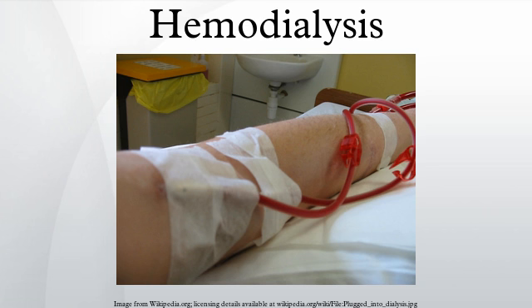Disadvantages: restricts independence, as people undergoing this procedure cannot travel around because of supplies availability, requires more supplies such as high water quality and electricity, requires reliable technology like dialysis machines, the procedure is complicated and requires that caregivers have more knowledge, requires time to set up and clean dialysis machines, and expense with machines and associated staff, equipment.